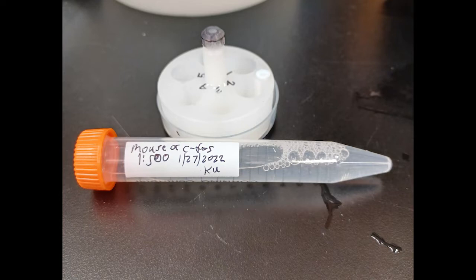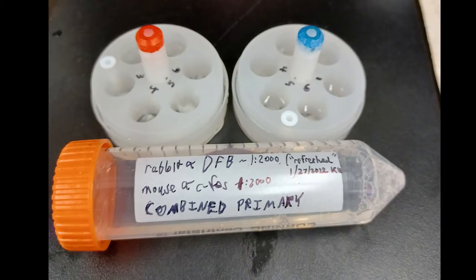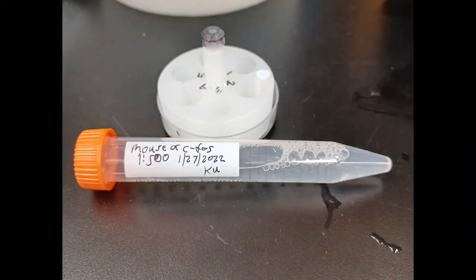Did you notice the colors of the net well handles in these pictures? The red and blue handled net wells have solution in them that you will pour into that bigger combined primary tube. And the black handled net well has solution that you will pour into the smaller C-FOS 1-500 tube.